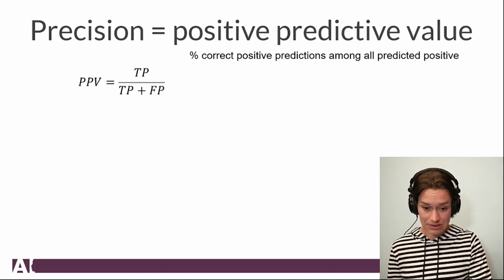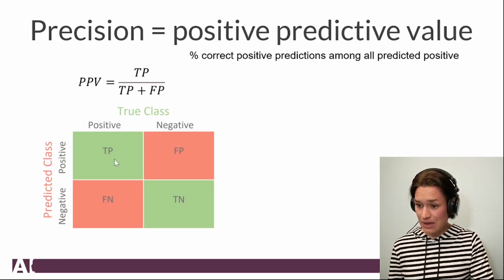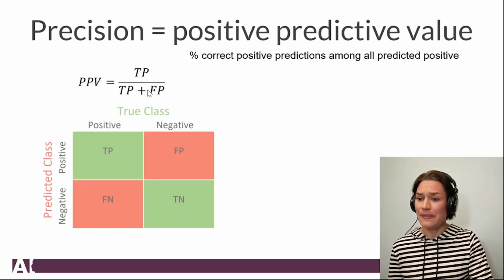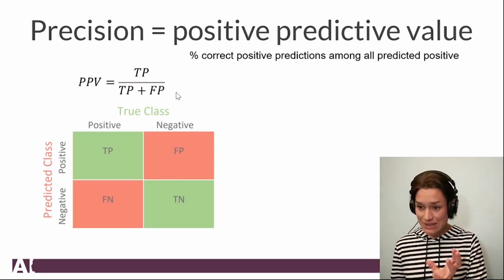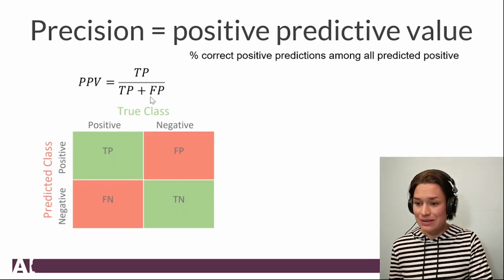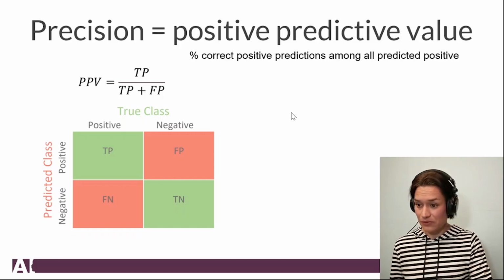And this probably doesn't tell you anything unless we see our matrix. So we have true positives over true positives and false positives. The number of errors that is going to cause us trouble are going to be the false positives. False negatives are not part of the equation. And this is also a little trick that I have seen in those metrics. You look at the equation and what's causing trouble and what is not. And then if this thing that is causing trouble is the problem, you optimize for this metric and the rest is not so relevant. Hopefully this helps as well.